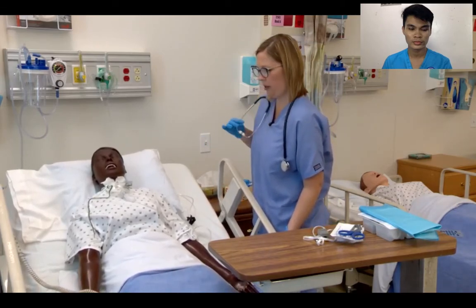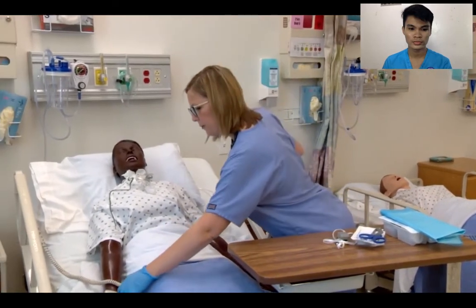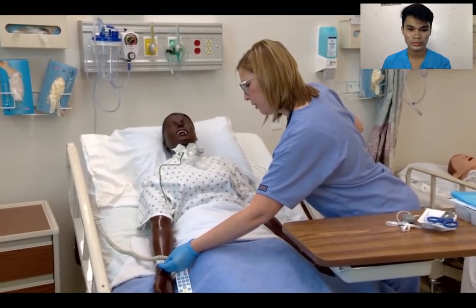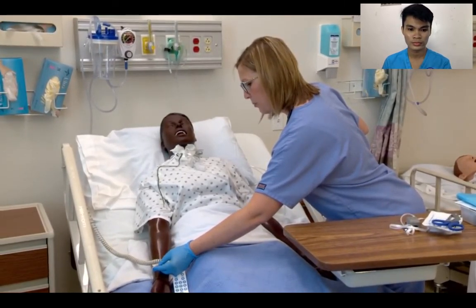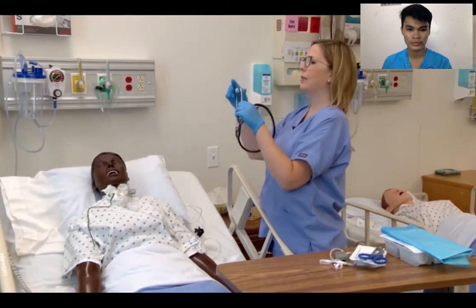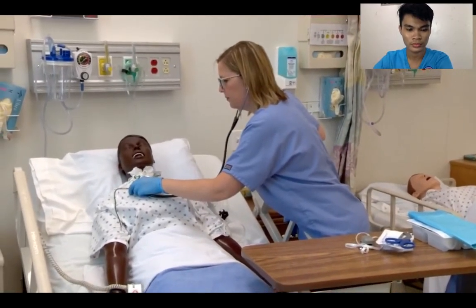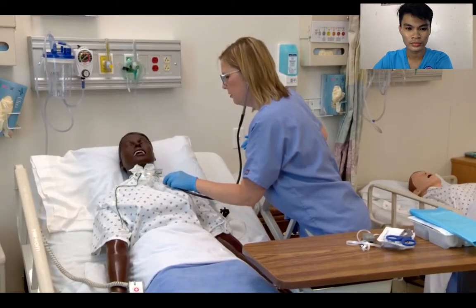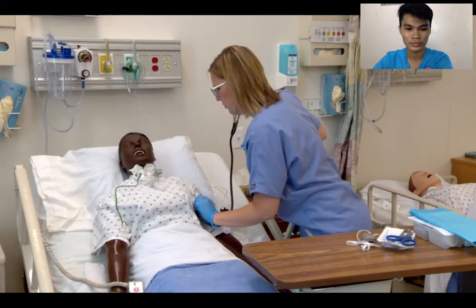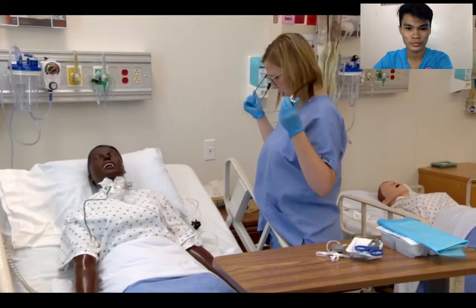Are you having any pain or anything? Okay, good. Can you tell me your name and date of birth? Okay, we have Jamie Jones, MR 589-135-1329, date of birth 1/16/62. Okay, good. Now I'm going to take a quick listen to you here. Take some deep breaths. Okay, and again. Alright. Sounds like we want to get some stuff cleared out of your chest there.